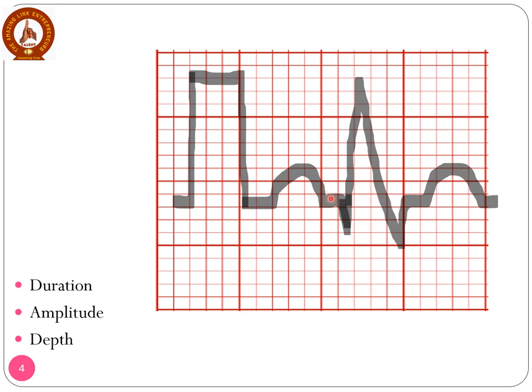Then this other diagram is the PQRST complex. So this is the P wave, this is the Q wave, this is the R wave, this is the S wave, and this is the T wave. Let's quickly look at how we can use vertical calibration and horizontal calibration for assessment of the waves and of this complex.